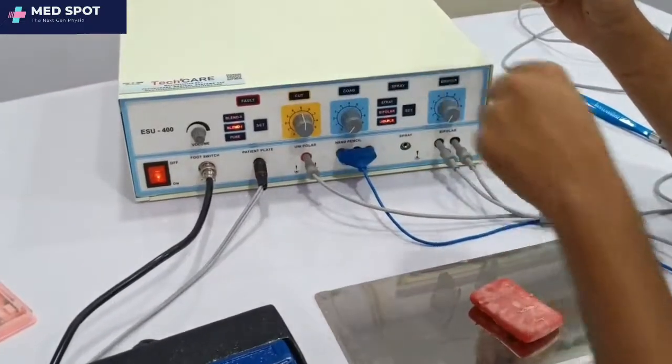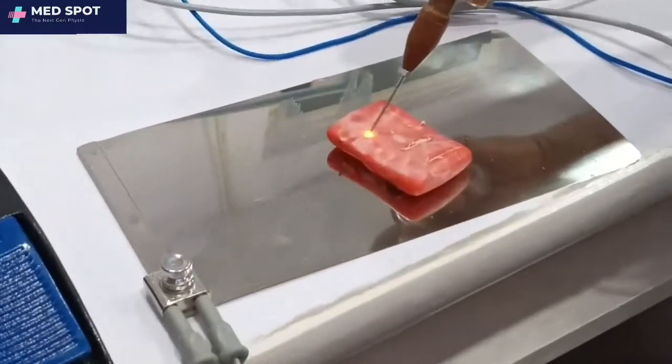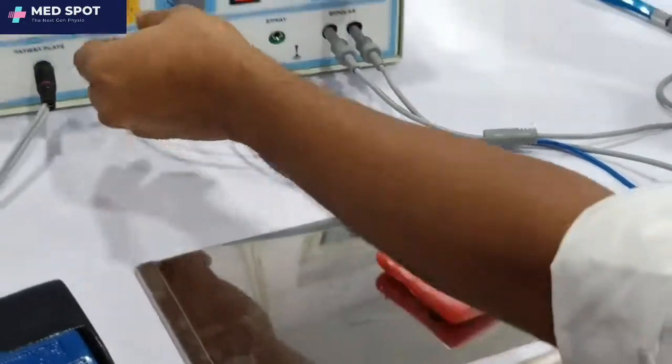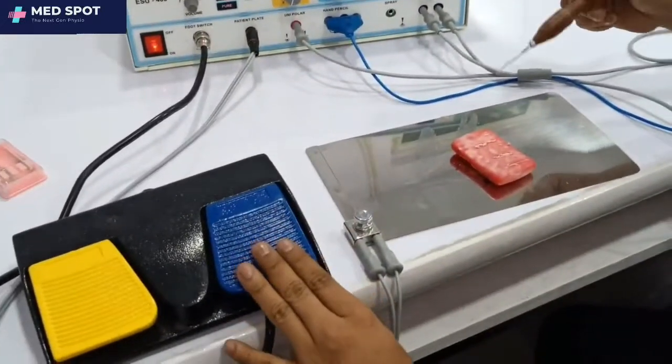The cut intensity is set to 5. You just need to press the yellow button to activate cut. Now this is the cut in operation. After that, if you need to use coag, press the blue button — this is the coag.